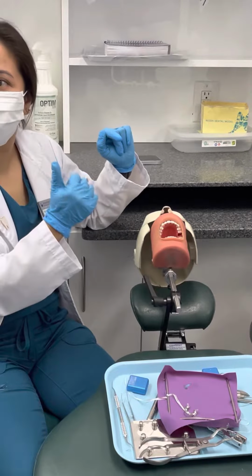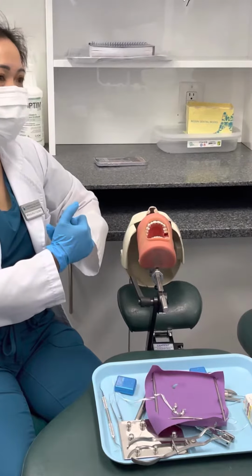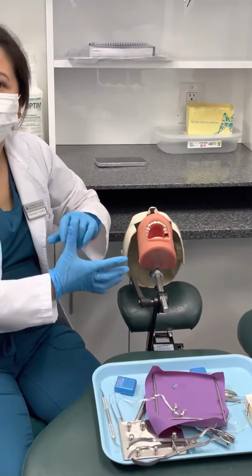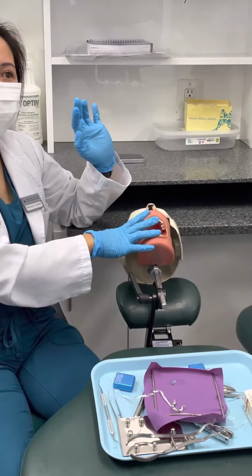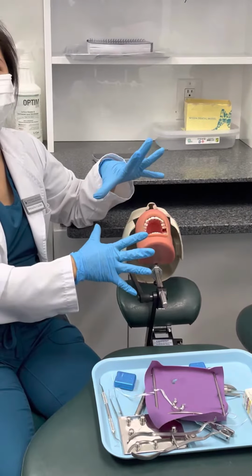If it's too difficult, like some people who complain about breathing, that's now the discretion of the dentist. Then you're going to put it down, just because you wanted to. You have to assess the patient's mouth and the situation of the mouth to see if you can put it on. But this is the best way to isolate and keep the moisture controlled.